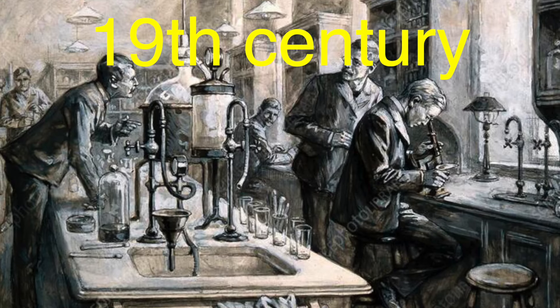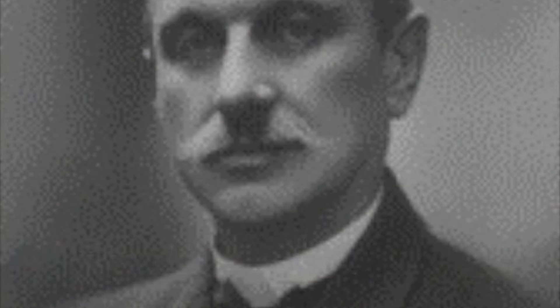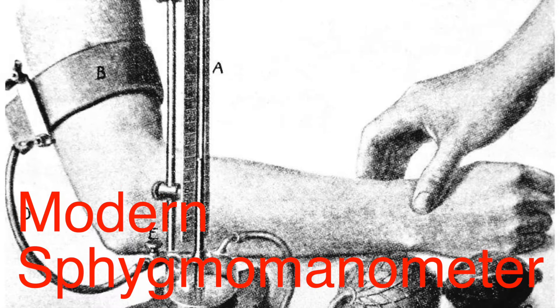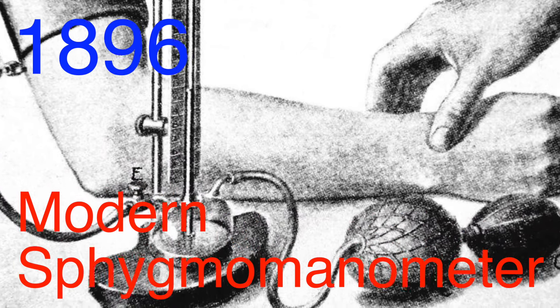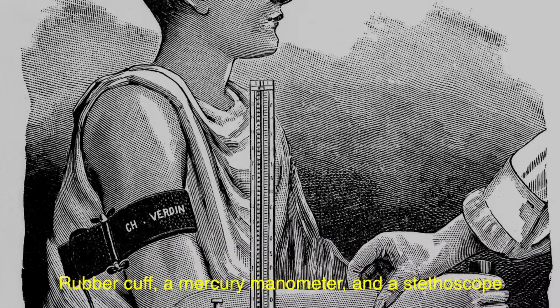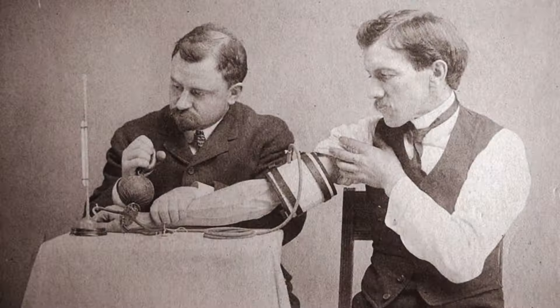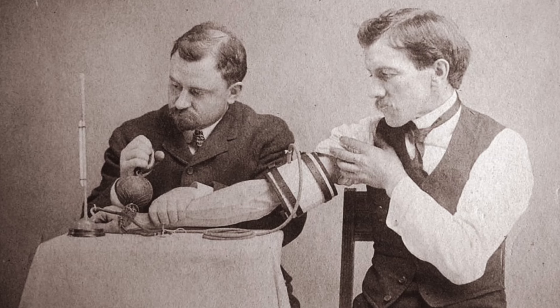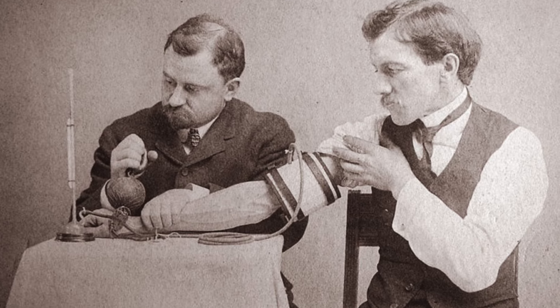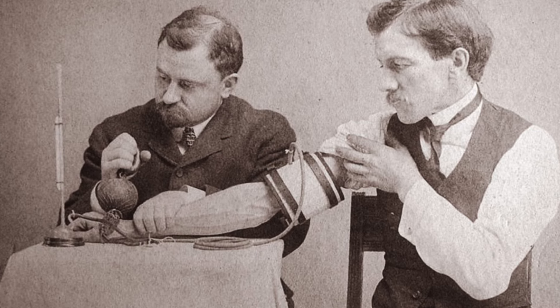By the 19th century, scientists and doctors were actively trying to find a less invasive way to measure blood pressure in humans. That's where Scipione Riva-Rocci comes in. He was an Italian internist, and his main contribution was the invention of the modern sphygmomanometer in 1896. His version used a simple rubber cuff to constrict the arm, a mercury manometer to measure pressure, and a stethoscope to listen to the pulse. The invention was a game-changer in the medical world, providing a non-invasive, reliable, and relatively easy method to measure blood pressure. Although Riva-Rocci's original design was bulky and awkward compared to what we use today, it laid the groundwork for modern sphygmomanometers.